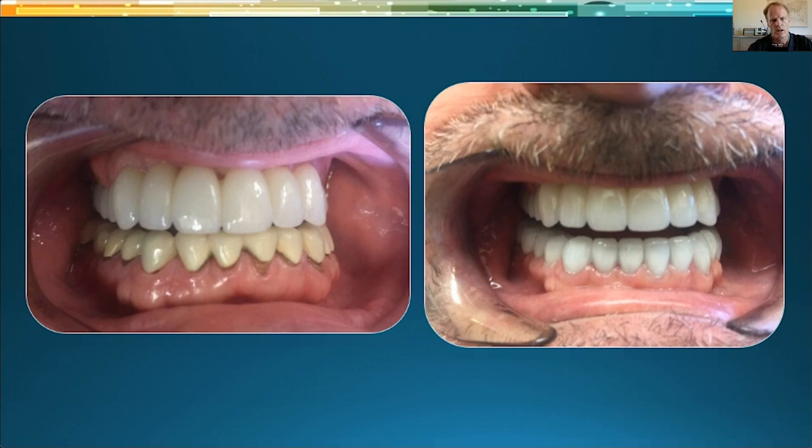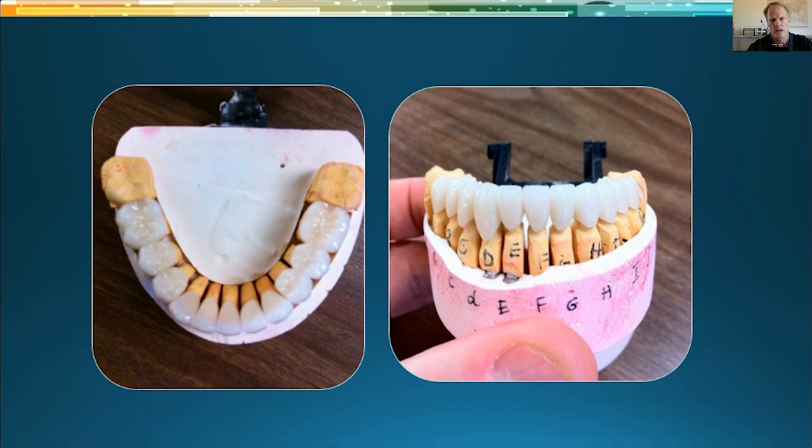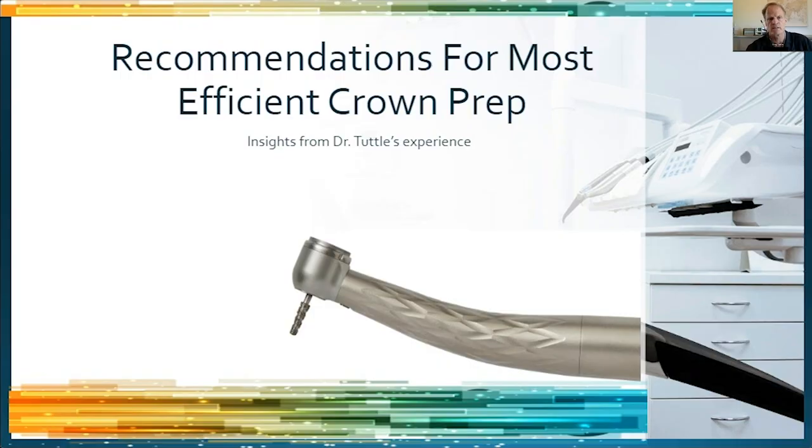Here's some other work that I've done. Today was a 16 crown placement day. I had to adjust a lot on the incisal length on the other anteriors, and I was glad I had the electric handpiece to do that.